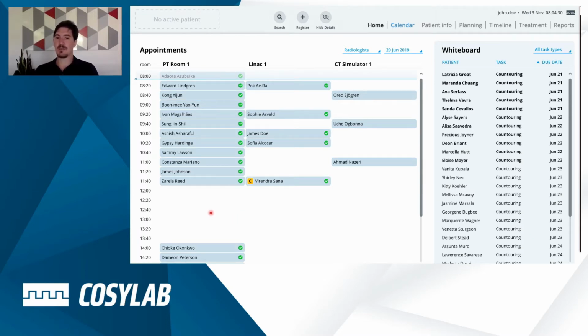Now let's demonstrate this by opening a patient called Mr. James Johnson that was scheduled for room PT1.